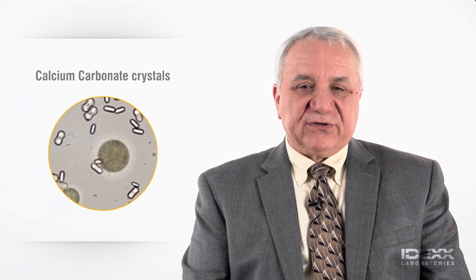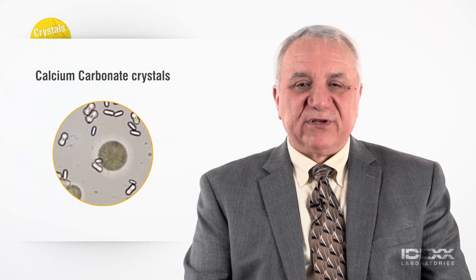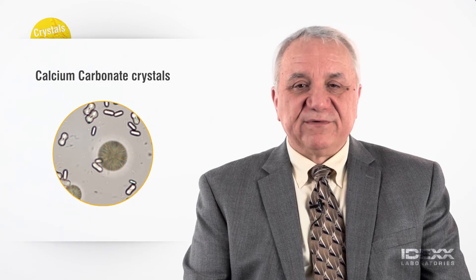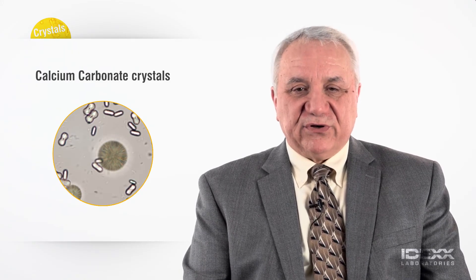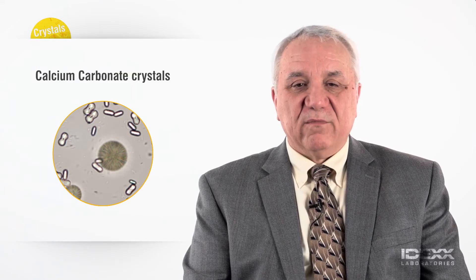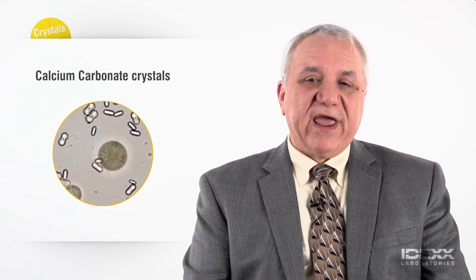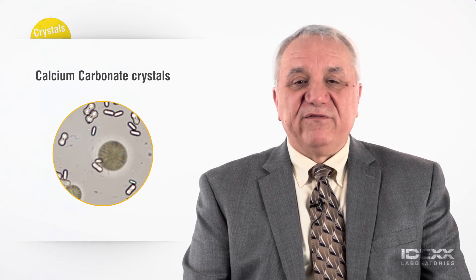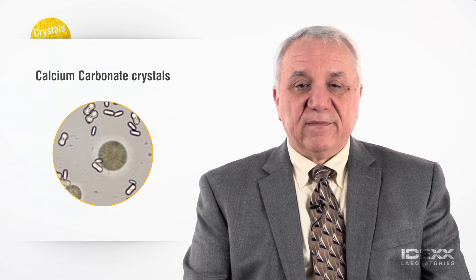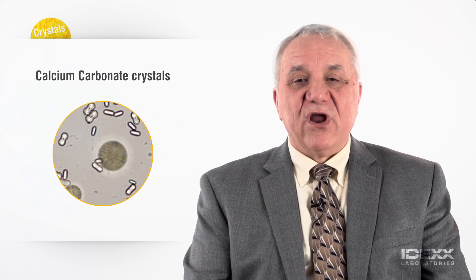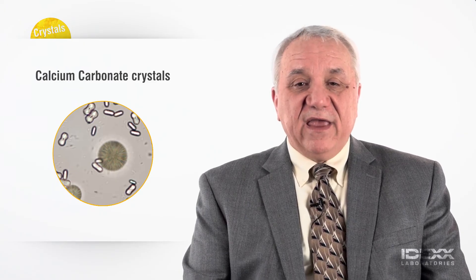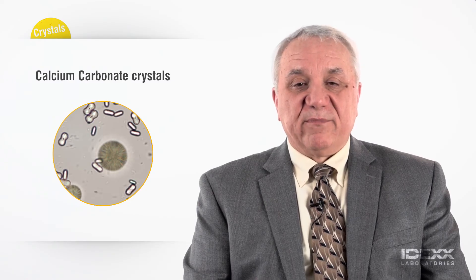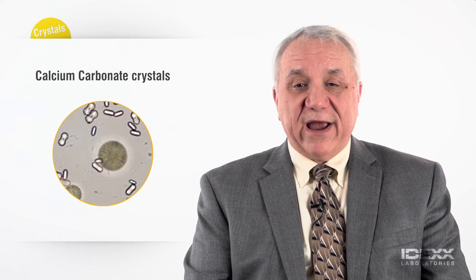Calcium carbonate crystals are commonly seen in horse and rabbit urine specimens. They are present in alkaline urine and typically demonstrate no clinical significance. They are typically small, colorless crystals that are present in dumbbell or spherical forms with potential internal striations, and in most cases a wide range of morphologic presentations are seen relative to different stages of formation. Calcium carbonate crystals are not described in dog and cat urine specimens. If similar shaped crystals are found in dog or cat urine, they are more likely to be representative of a form of calcium oxalate monohydrate crystals.